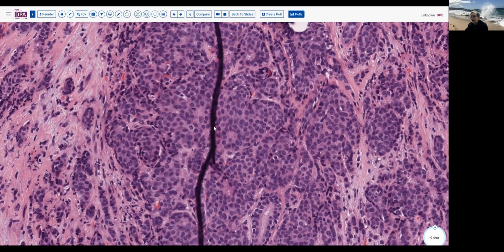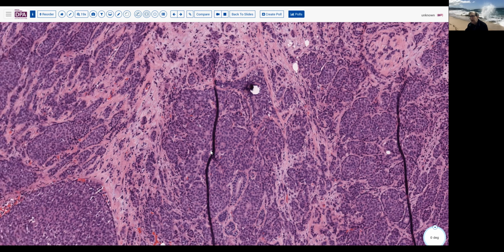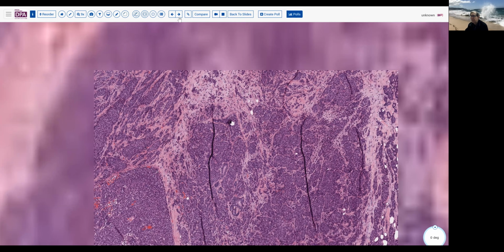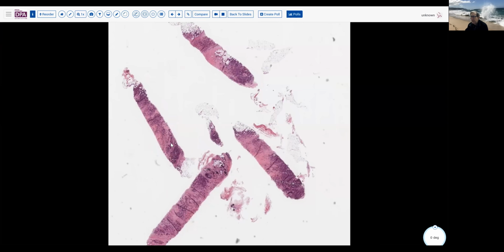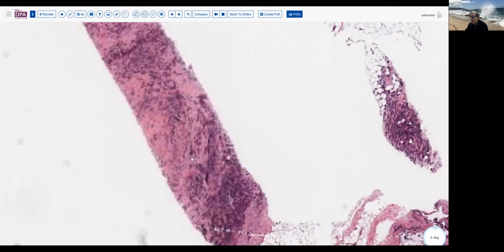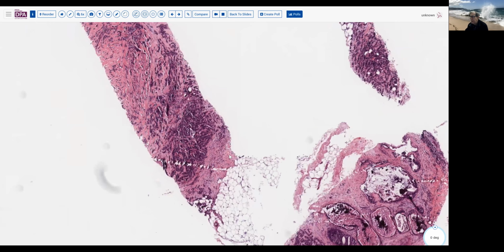Perhaps another one there. So this could be a 3-2-2, probably a grade 2 tumor based on that frequency of mitotic figures. Another example, again posted as an unknown for you to examine and make your determination. Seeing the number of cases that we've got should help you.